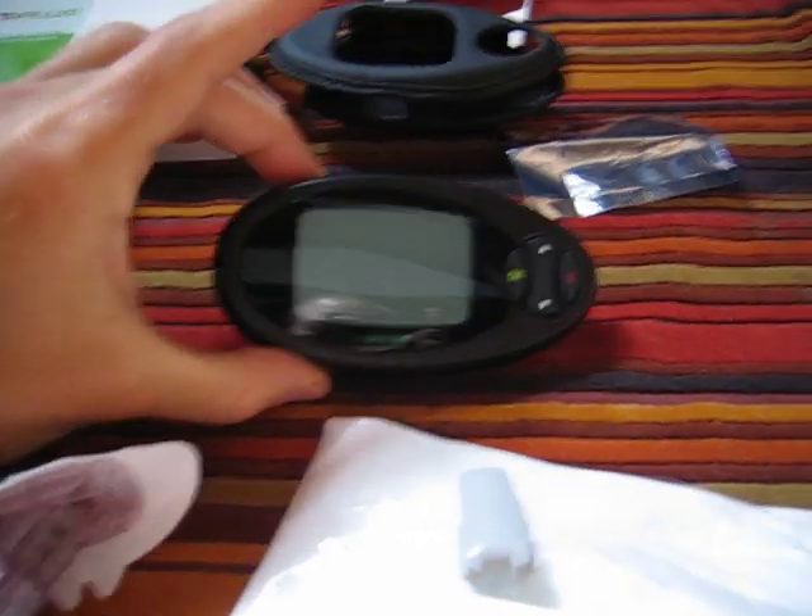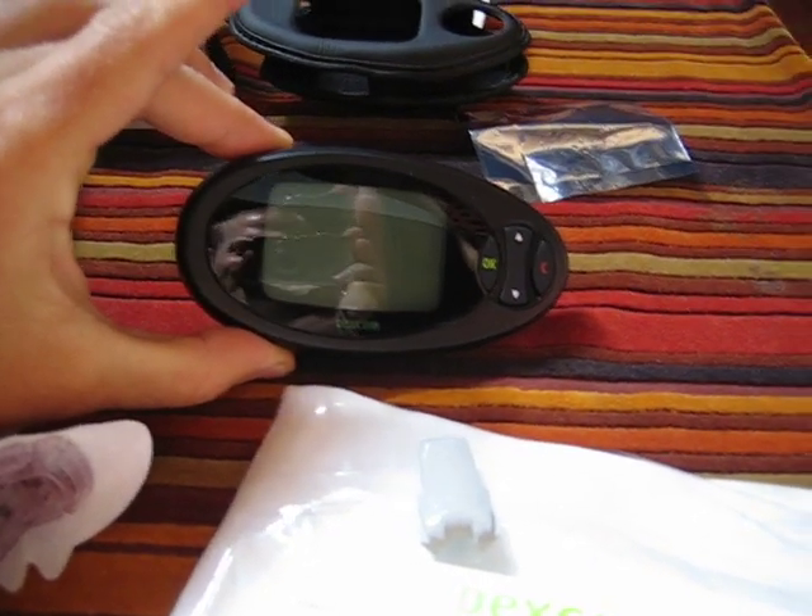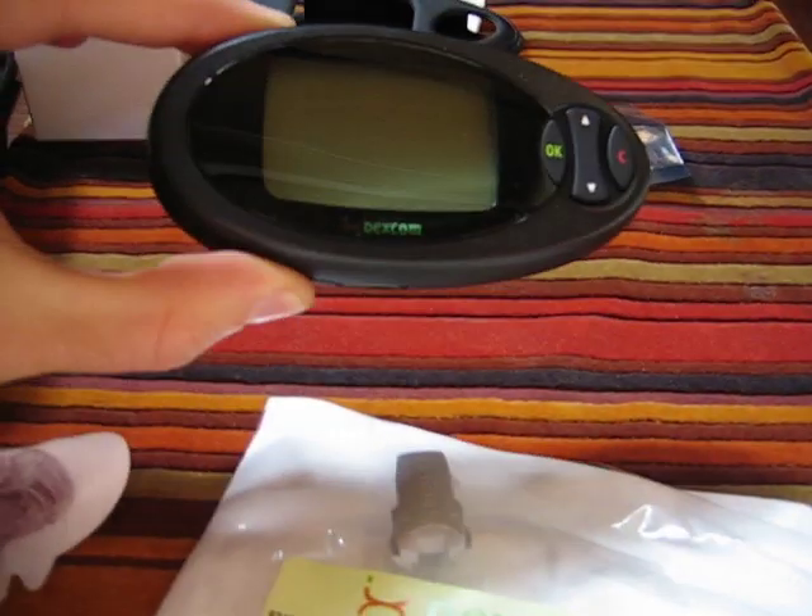Hi. This is Tim Ferriss. I'm about to implant a small device in my body. You can see here, this is the Dexcom Continuous Glucose Monitor. This is what will actually show me my data as well as reception and things of that type.